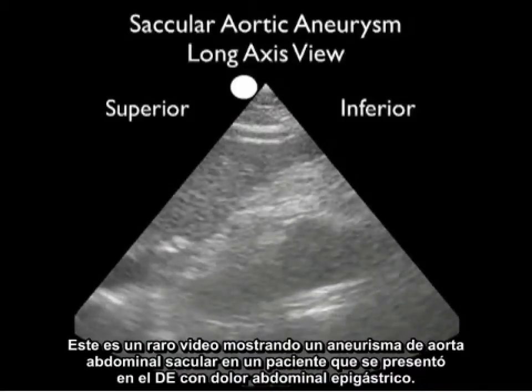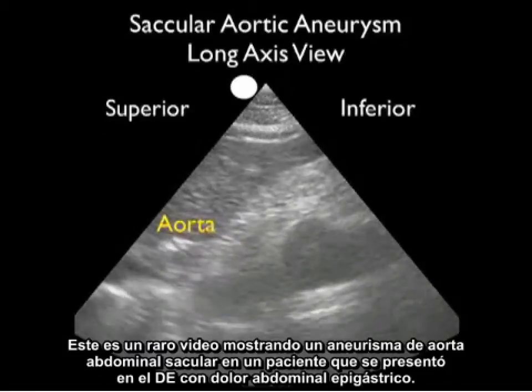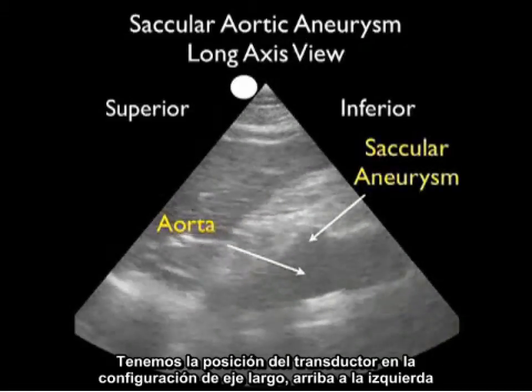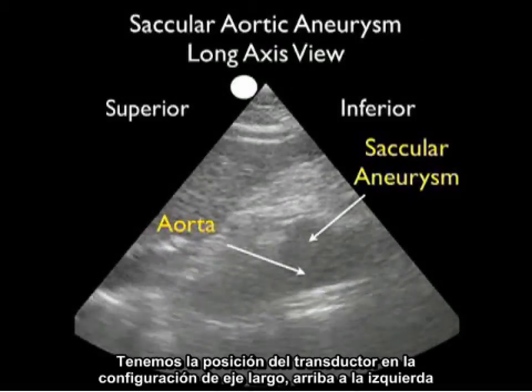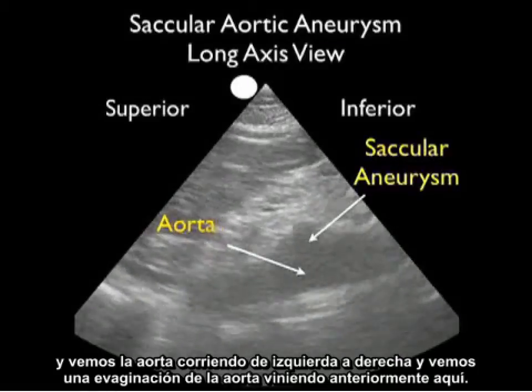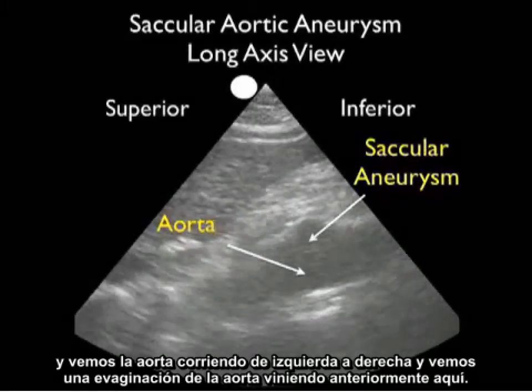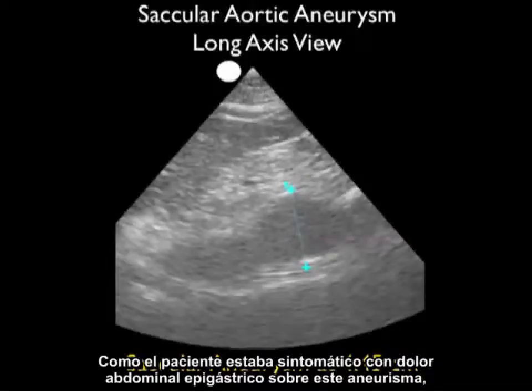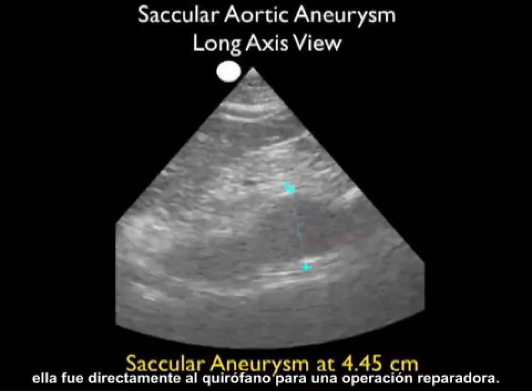This is a rare video clip showing a saccular abdominal aortic aneurysm in a patient who presented to the ED with epigastric abdominal pain. With the probe in long axis configuration, we see the aorta running left to right and an outpouching coming anteriorly — that's the saccular aneurysm, measuring 4.45 centimeters. Because the patient was symptomatic with epigastric pain over this aneurysm, she went directly to the operating room for operative repair.